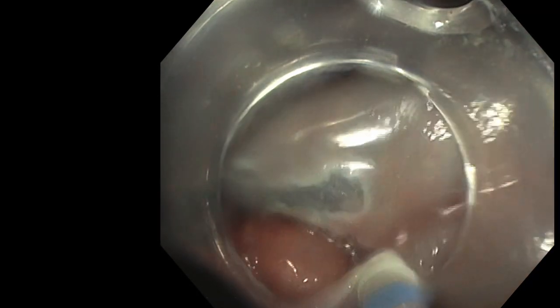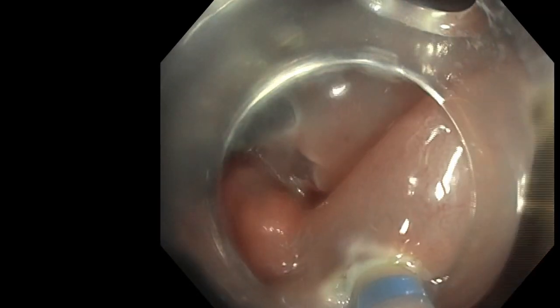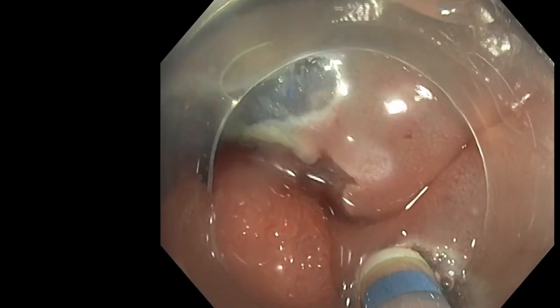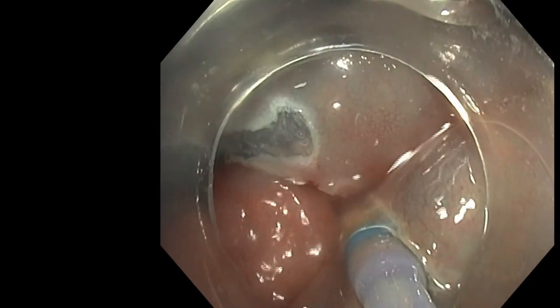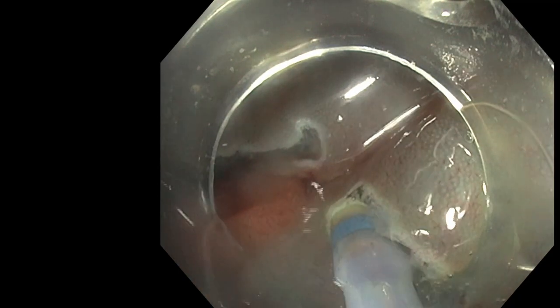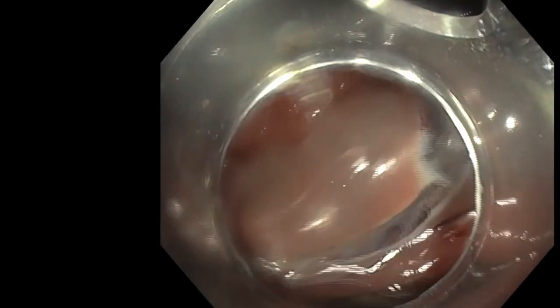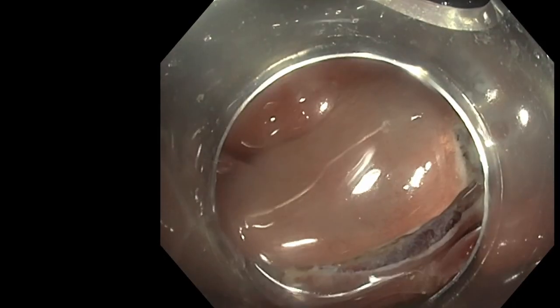But if you do your trimming immediately after the incision, the liquid is still trapped, still blocked in the submucosa, and then it's easier to do your trimming and to access the submucosal layer relatively quickly.